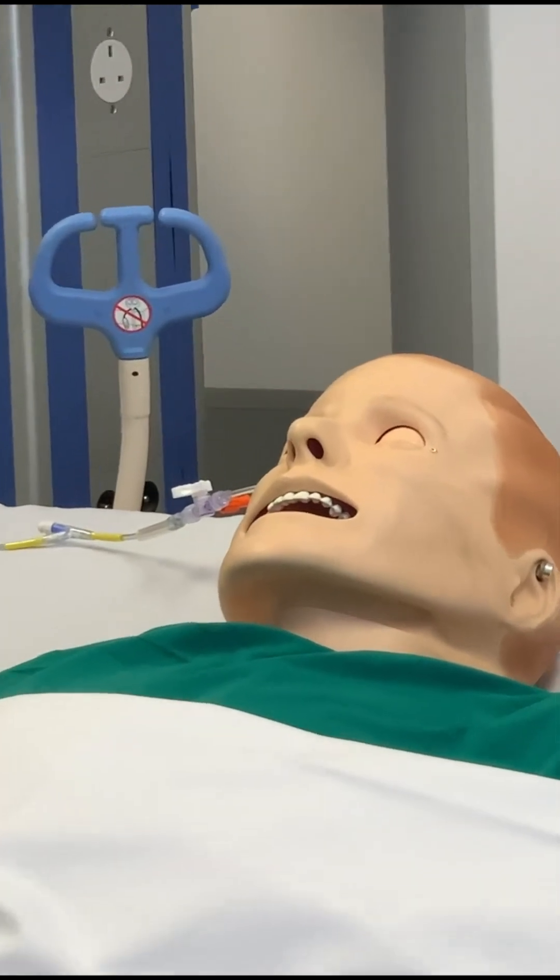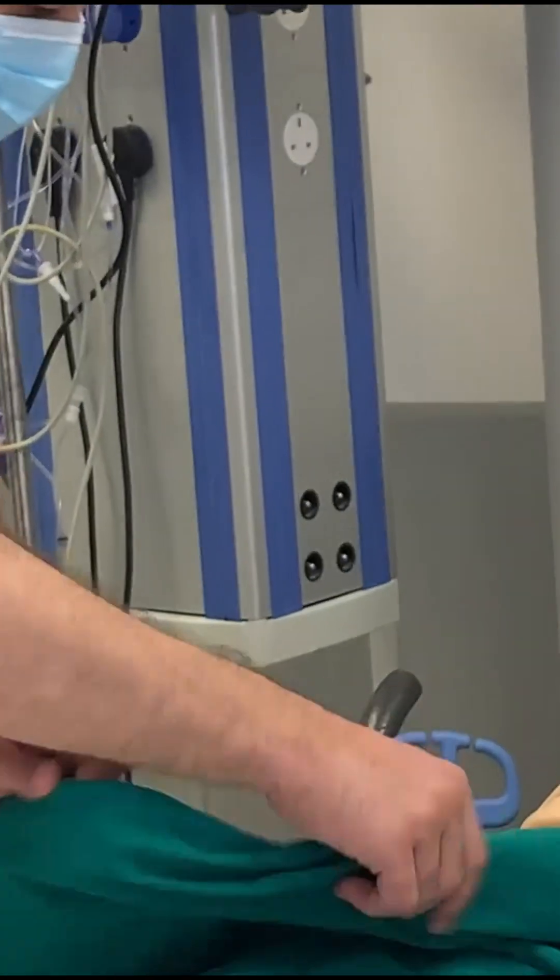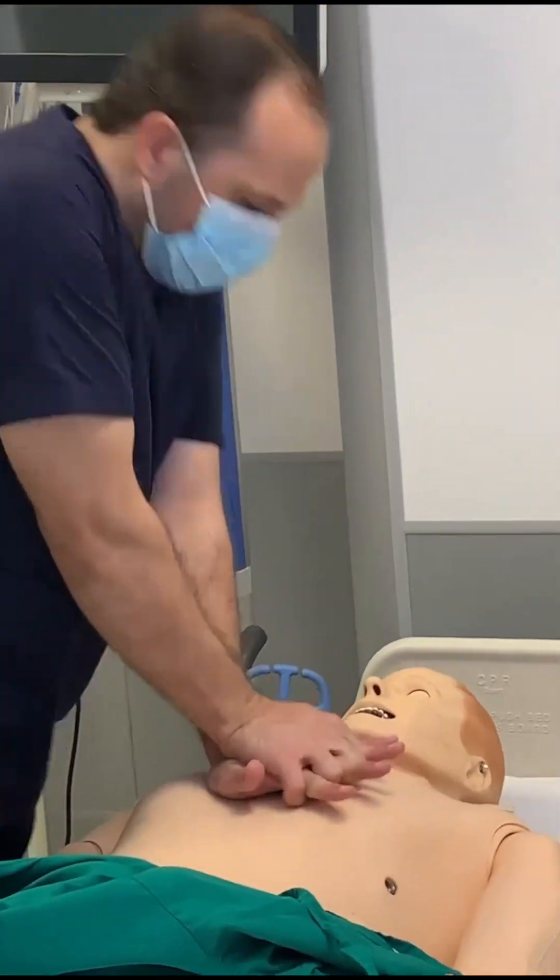Your patient has no response, no pulse, no breathing. You activate the code, you start compressions. This is great.